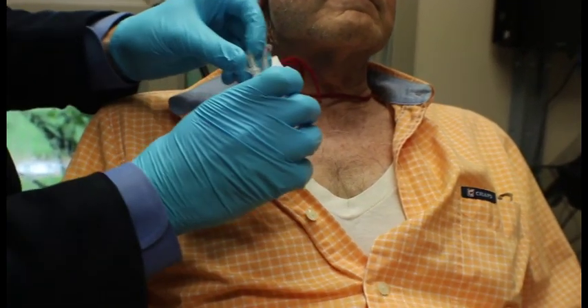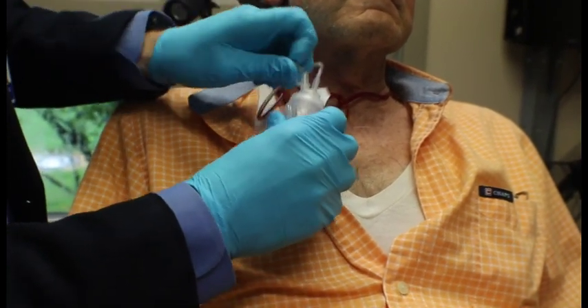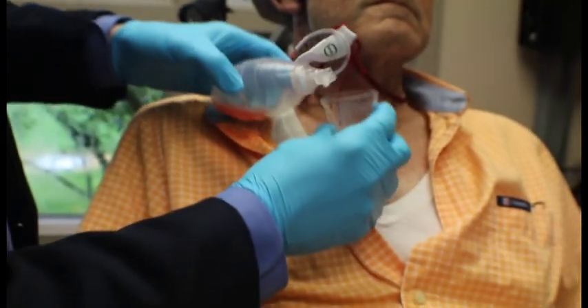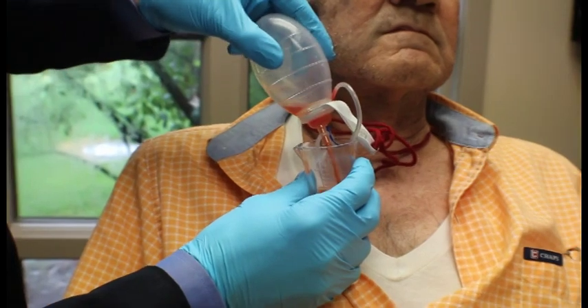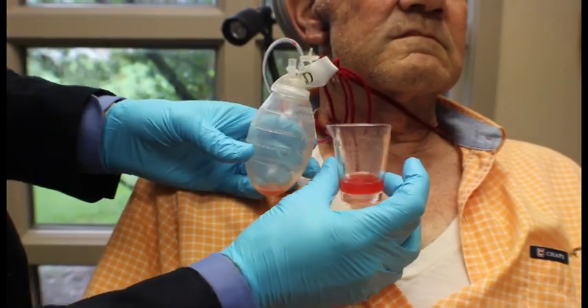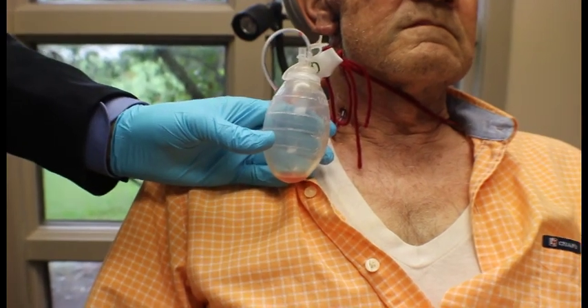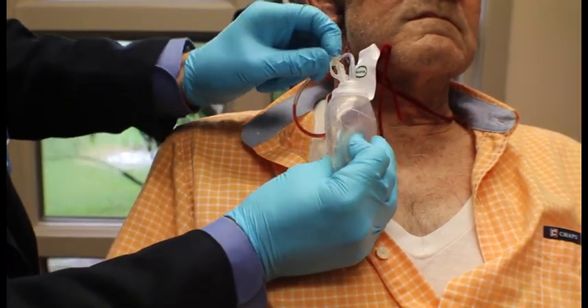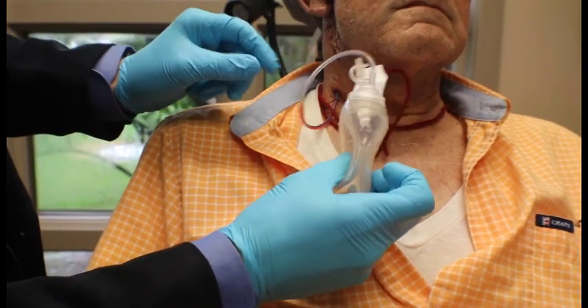To empty the drain, you take off the seal and pour the drainage into a measuring cup, which you can record in your drain diary. Then you recharge the bulb and replace the seal so that it's sucking again.